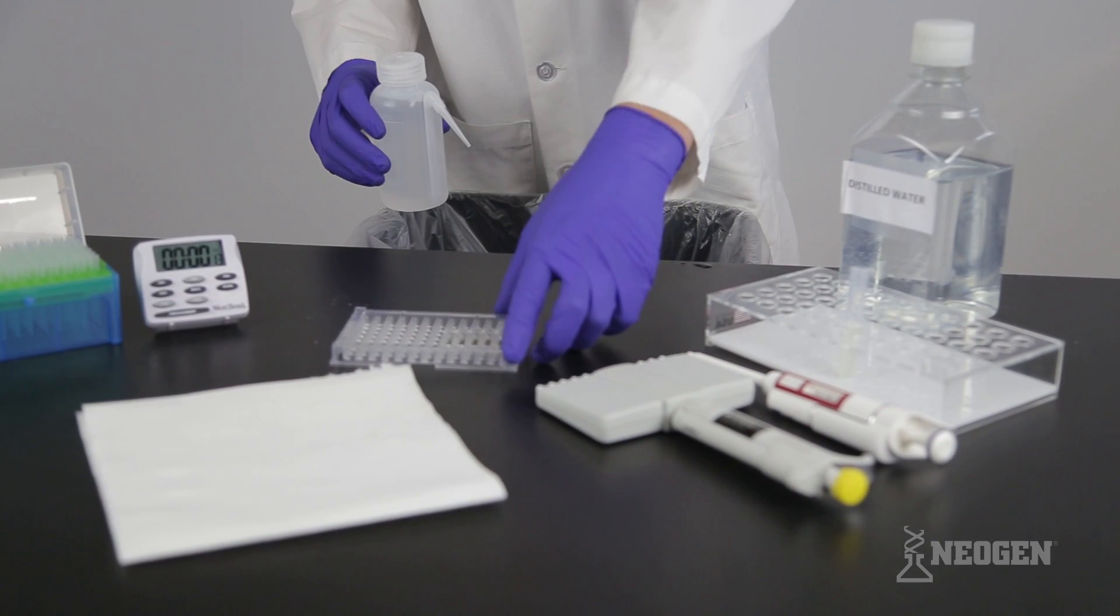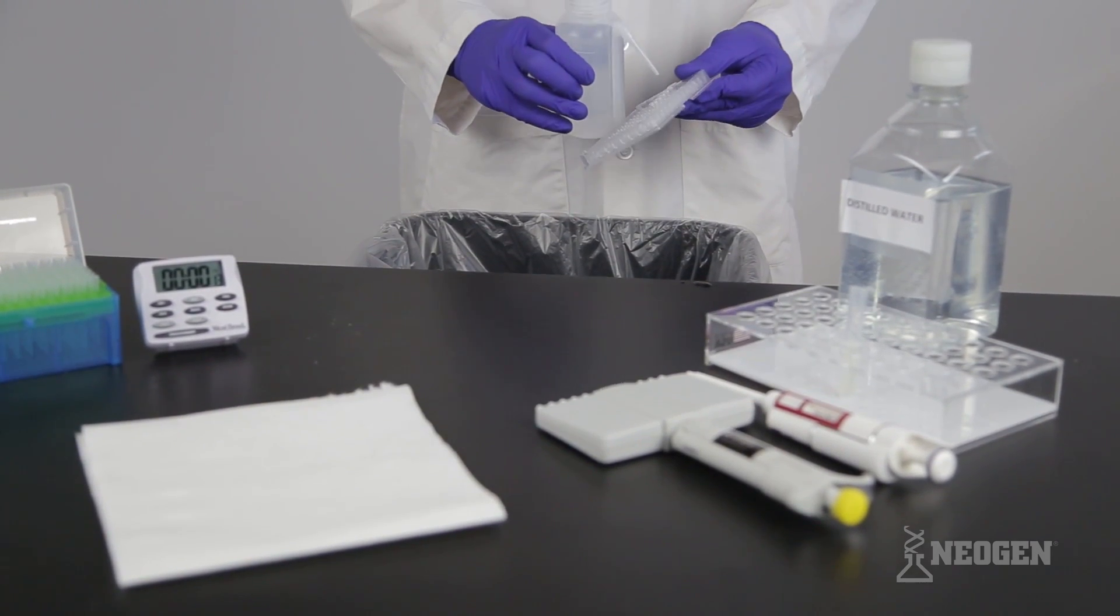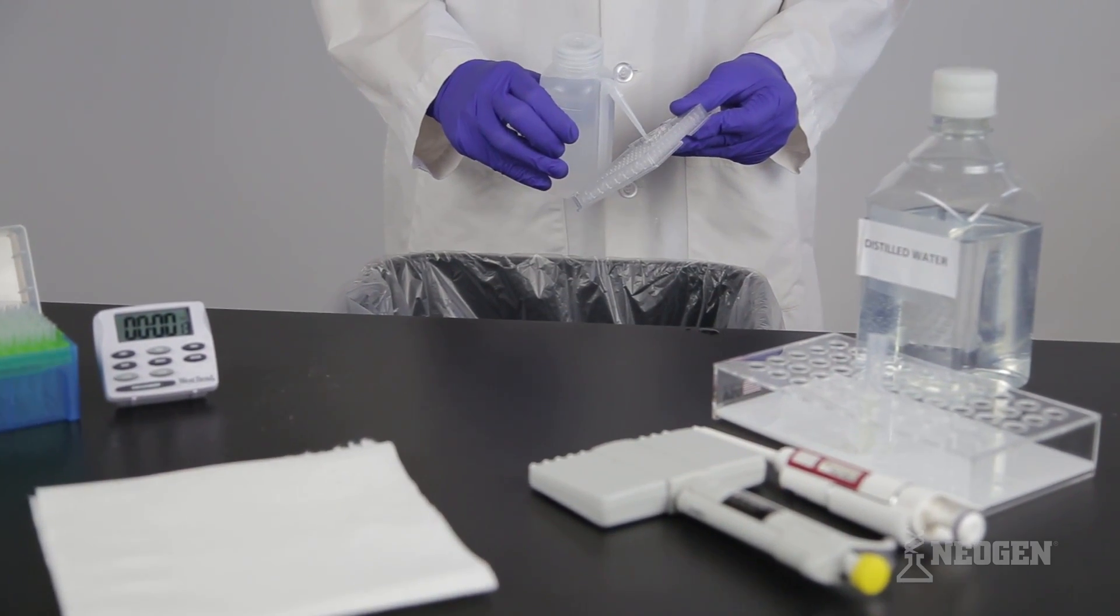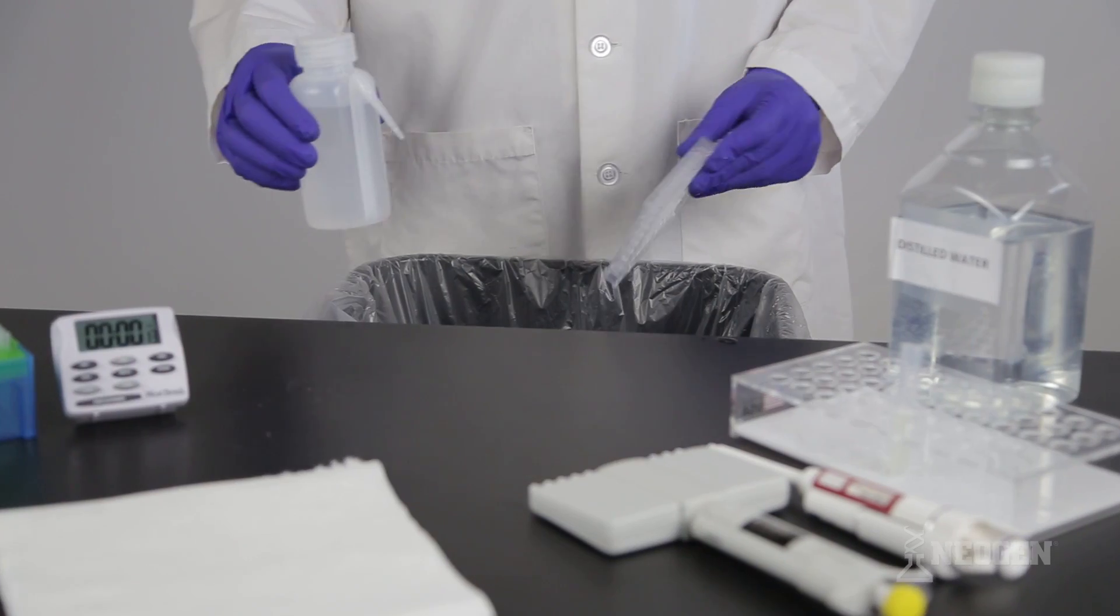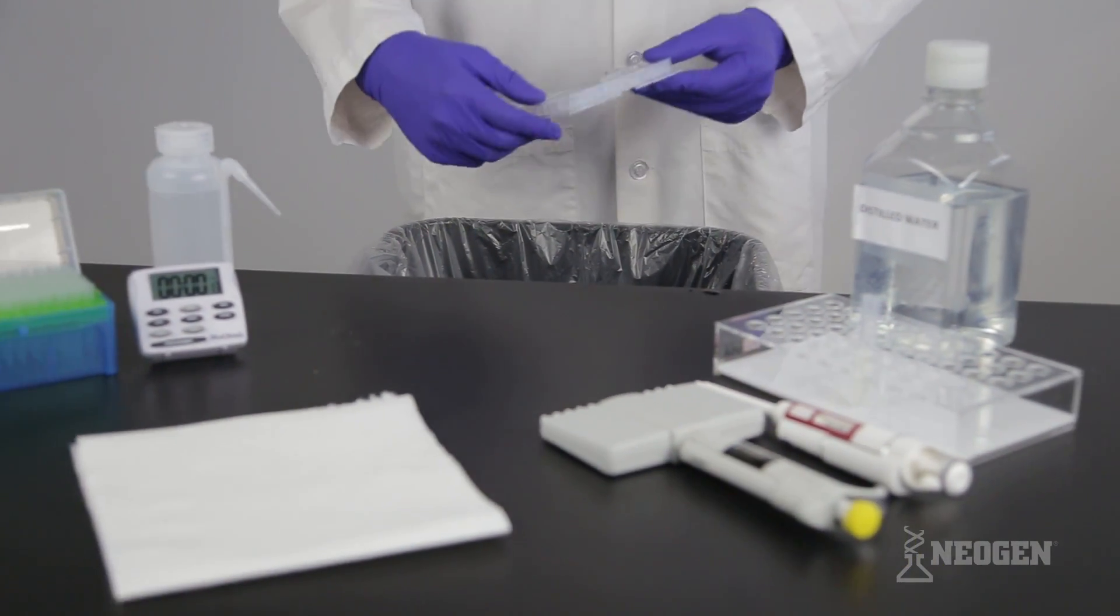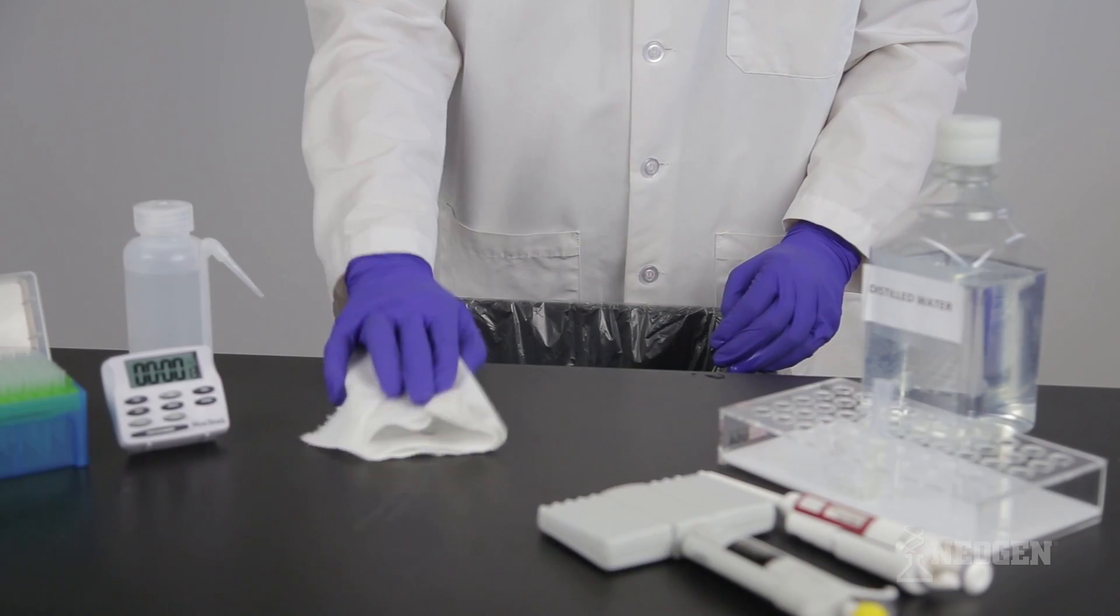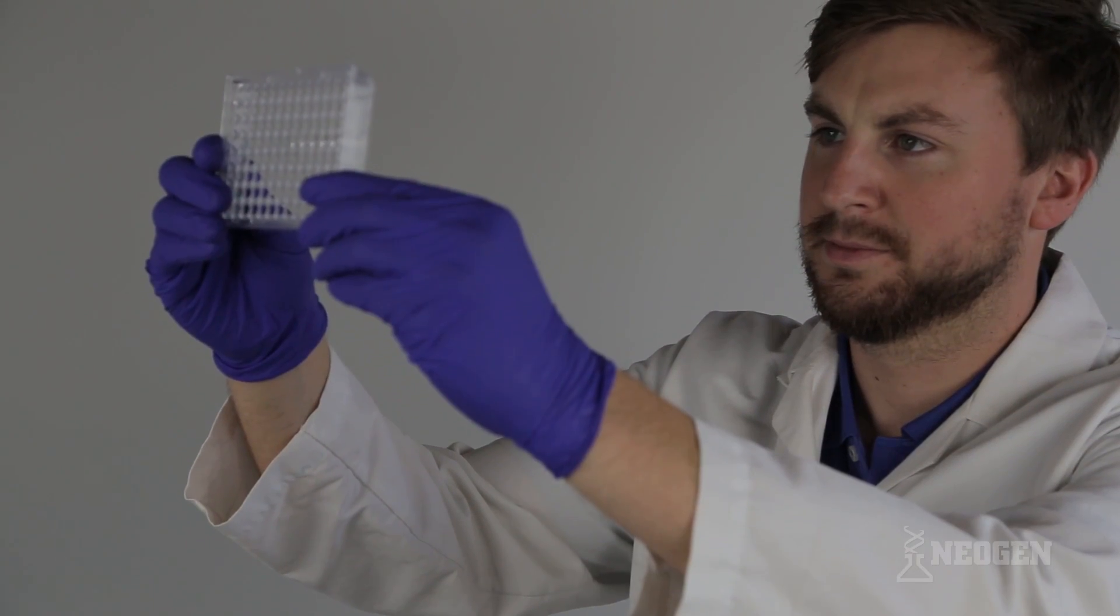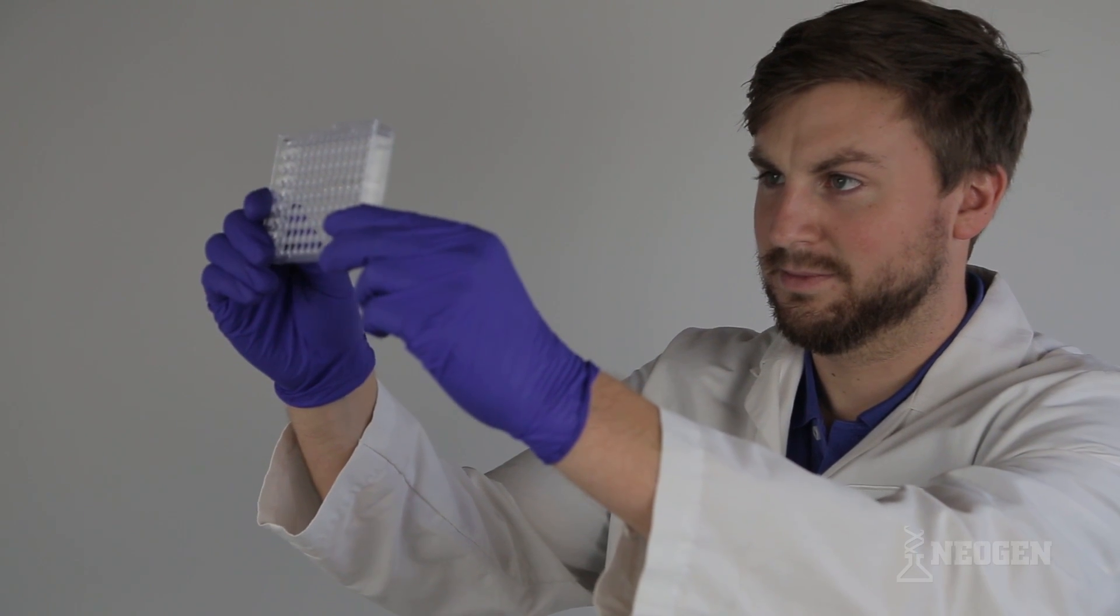At the end of the five minute incubation, shake out the contents of the microwells. Fill the wells with distilled or deionized water and shake out. Repeat this step five times, then turn the wells upside down and tap them out on a paper towel until the remaining water is gone. Check for excess water or bubbles. If present, tap again to disperse. Do not put anything in the well or blow air into the wells.